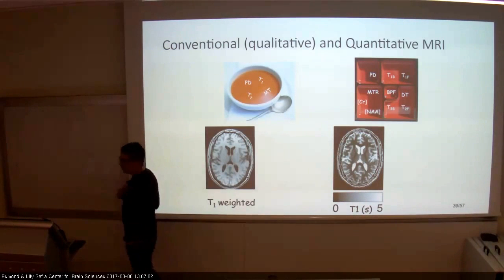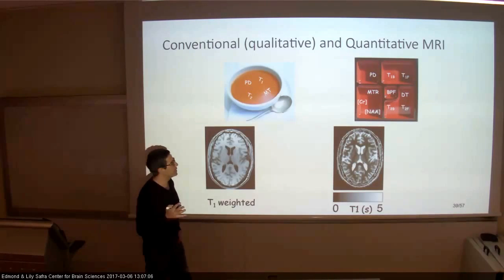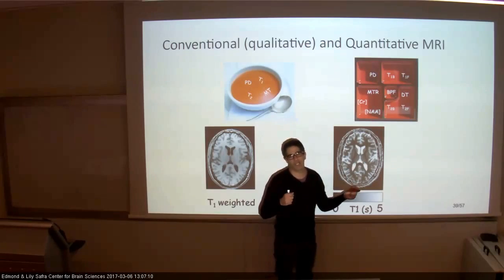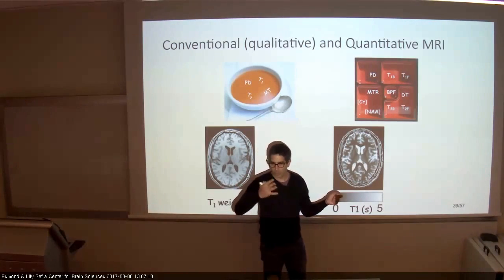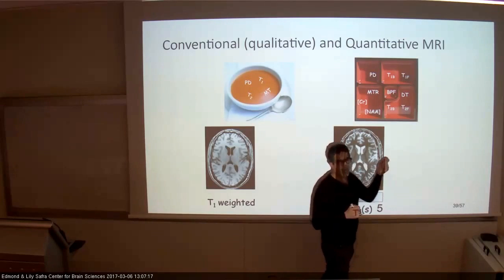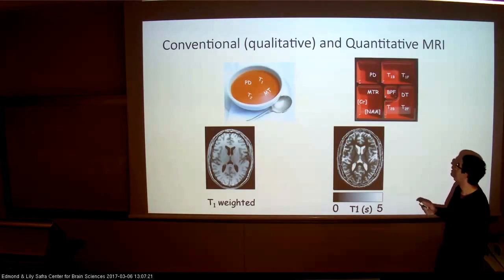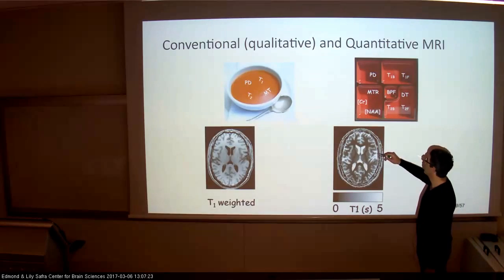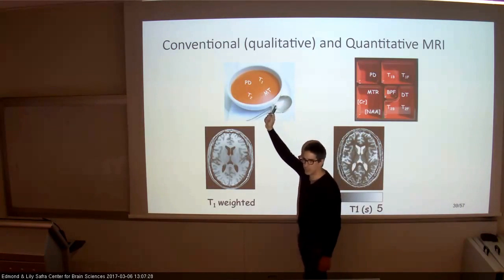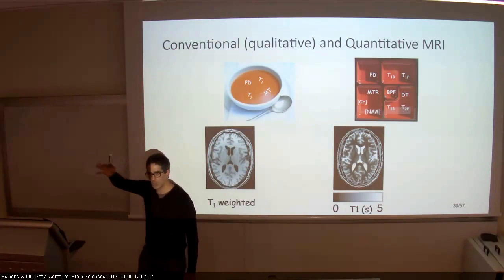in neuroscience. So what I want you to remember is that we talked before about these quantitative images, right? If we acquire an image in different inversions and so on, we are able to measure the T1, the relaxation time, and its position. And there are different sources of signal: T1, T2, magnetization transfer, which I will define later, and proton density, which is the fraction of water to non-water.